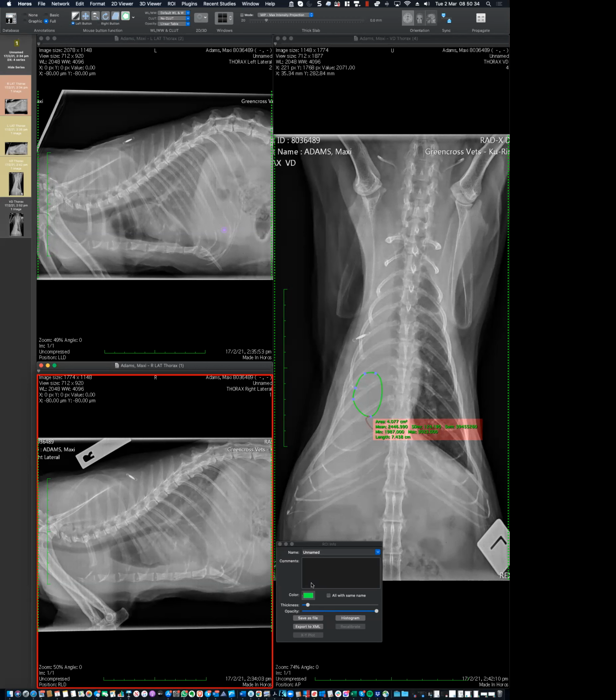We aspirated what looked like pus from the solid lung that we thought was actually a granuloma, and we aspirated just some modified transudate pleural effusion, but that had a carcinoma diagnosis, and the other was just a necrotic mass, necrotic lung tissue. Yeah, so that in my eyes fits perfectly fine.